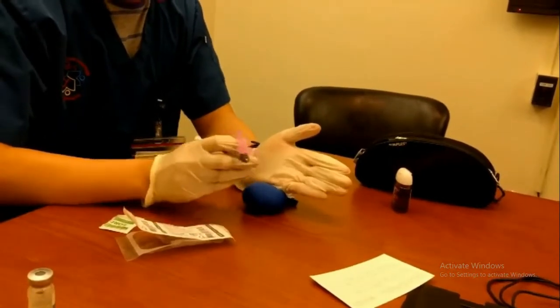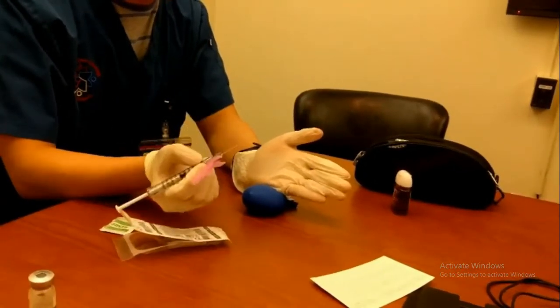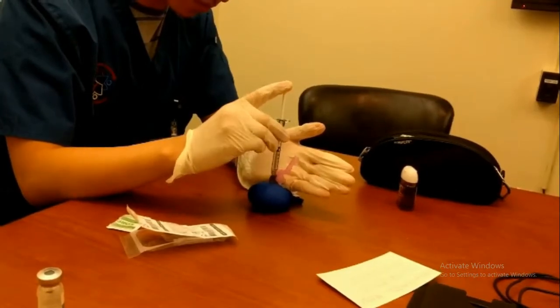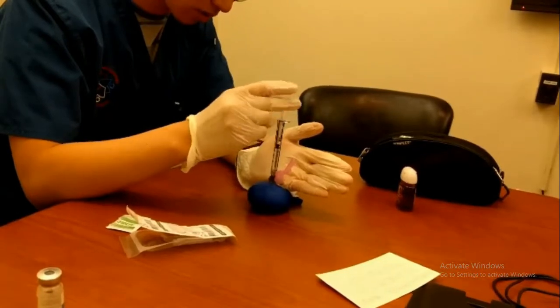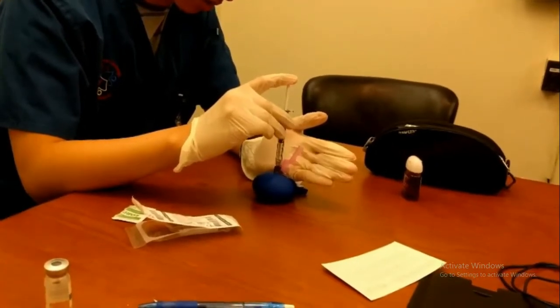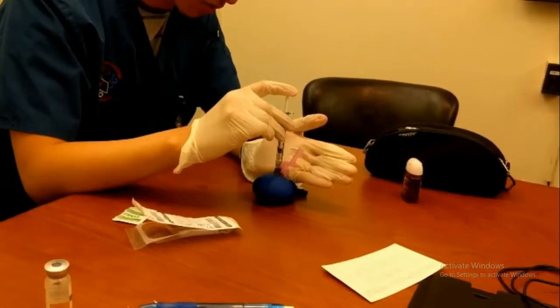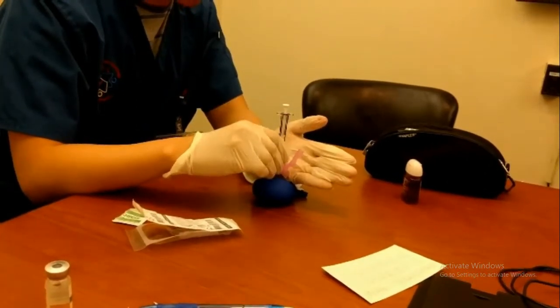It would be easier on a person and I wouldn't have to use my other hand to hold. And then going at it at a 90-degree angle, like so. And so first I will aspirate to see if there's any blood. So there's no blood, so I have not hit a vessel, so it is in the muscle. So I'm safe, and I go in, injecting the fluid a little bit at a time. 1, 2, 3, 4, 5, 6. Alright. So now I'm just going to hold it here for 10 seconds.